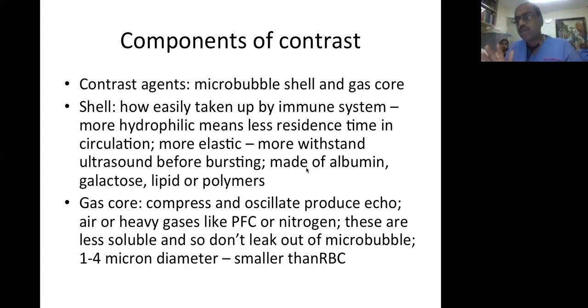But these are not going to work across the lungs because these bubbles will be larger and they will be broken by the time they reach the pulmonary circulation and come out of it. It will not escape the pulmonary circulation and reach the left side of the heart unless there is a communication like a pulmonary AV fistula or a PFO or a VSD or a PDA, which is shunting right to left.